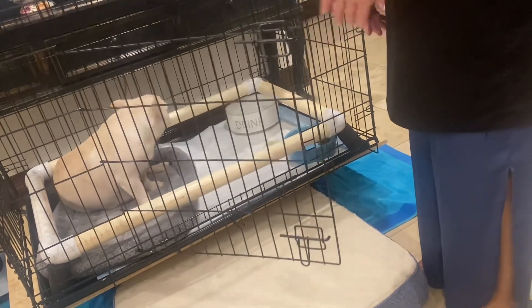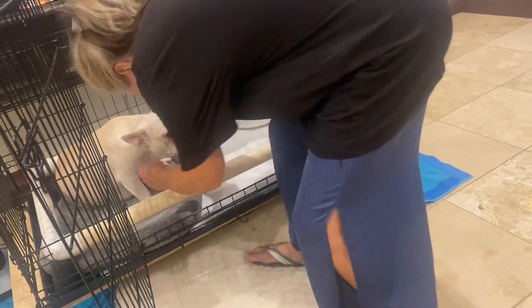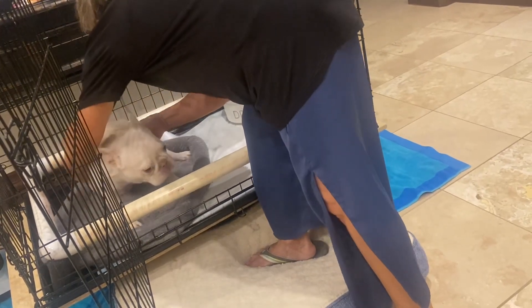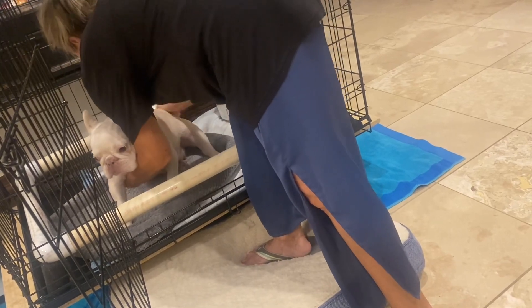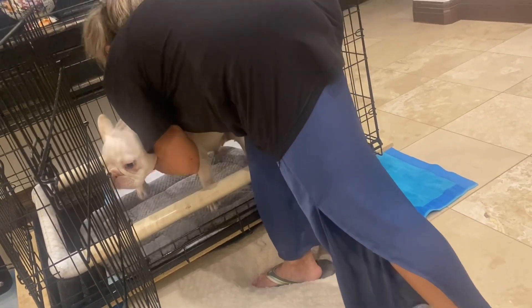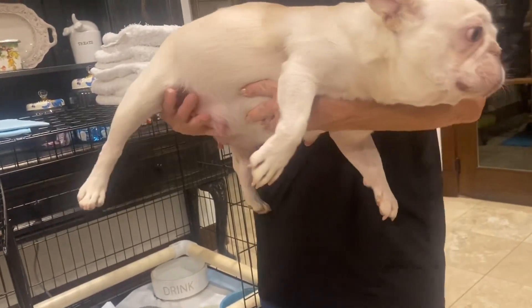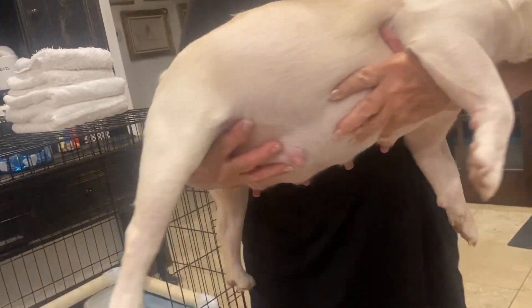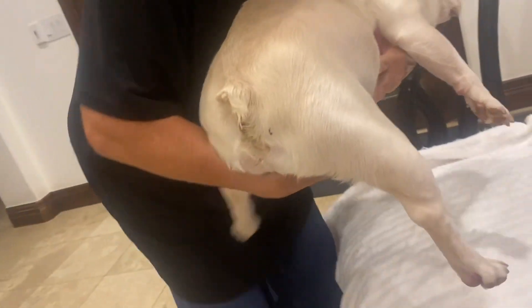We are going to take blood out of her forearm, just below the elbow on the front leg. I like to do it on the left leg because I'm right-handed, but either one is fine. Notice how she's being carried — no pressure on her belly, arm supporting underneath. That's the way I like to carry a big pregnant dog.